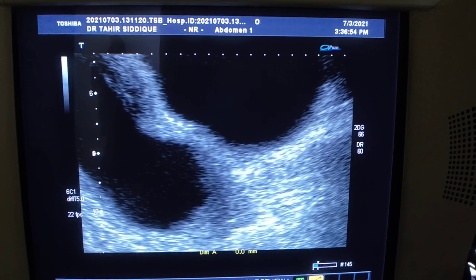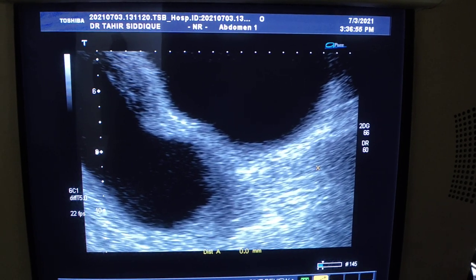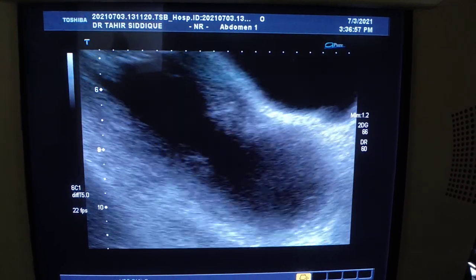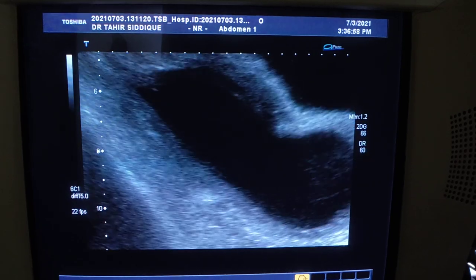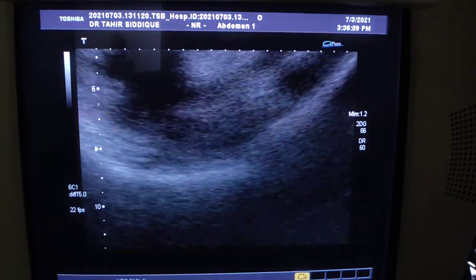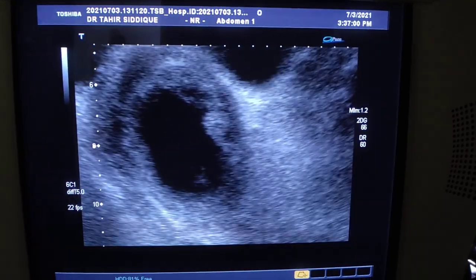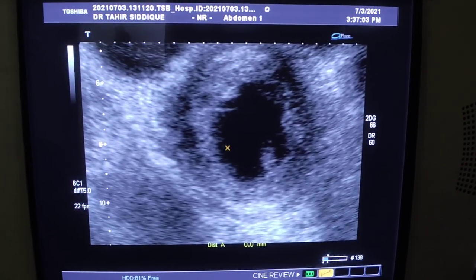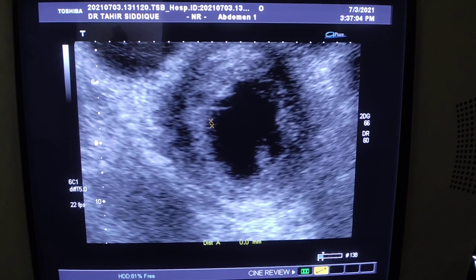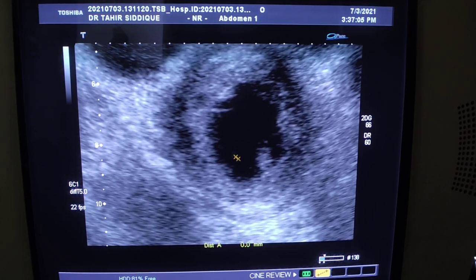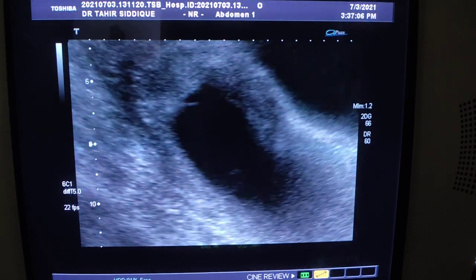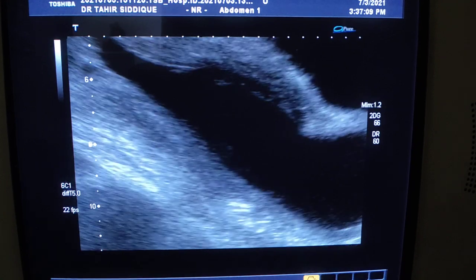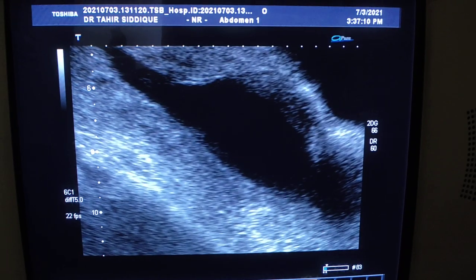This is hematometra. This is the lower portion — the cervix and the vagina — and it does not extend beyond there. This is the transverse section of the same area, confirming hematometra. This is the first finding in this patient.